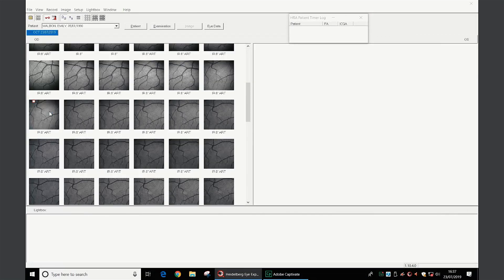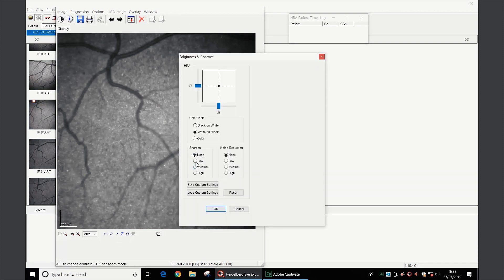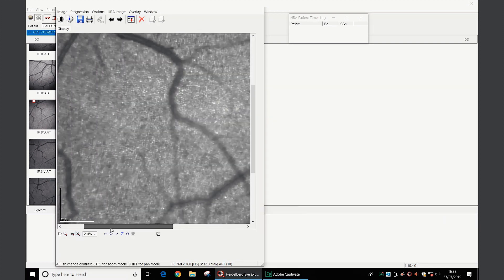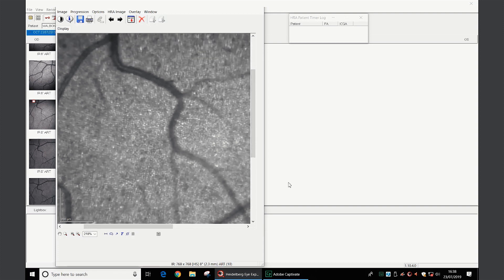For optimum visualization of photoreceptor structure, apply a low or medium sharpening to infrared fundus reflectance images. The pattern of the photoreceptor architecture can then be more clearly visualized.